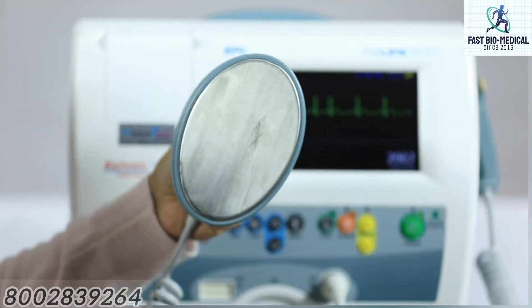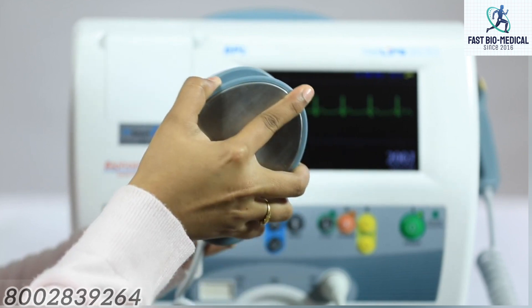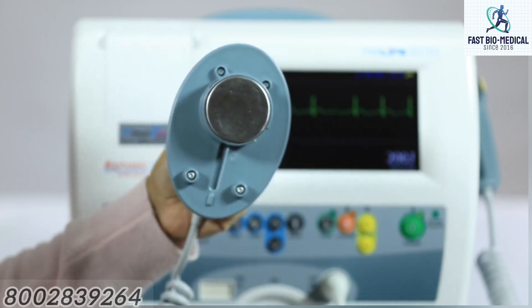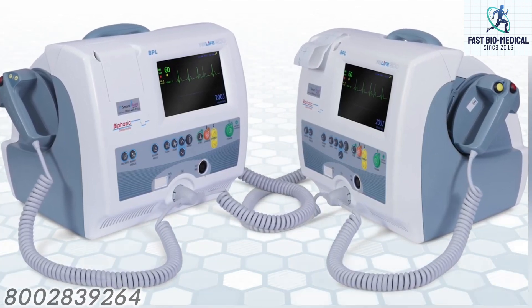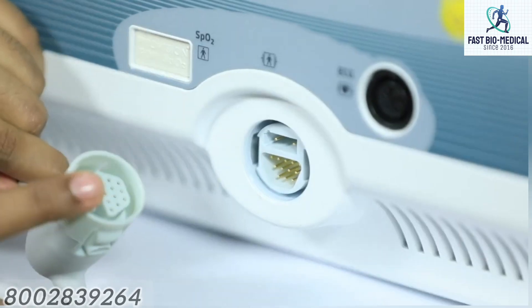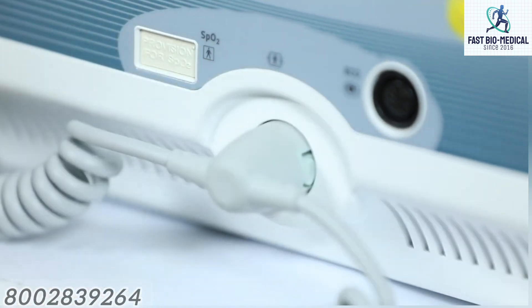Connecting the defibrillator paddles: the defibrillator has standard external paddles which include both adult and pediatric paddles. To expose the pediatric paddles, hold the adult paddle plate and twist the paddle by its handle — the adult paddle plate will come out fully to expose the pediatric contact surface. To connect the paddles, insert them into the holder on the defibrillator unit, align the plug with the defibrillator output socket at the bottom of the front panel, and push the plug fully into the socket. The plug locks to the socket with a click sound.